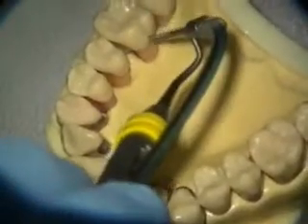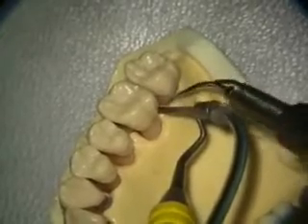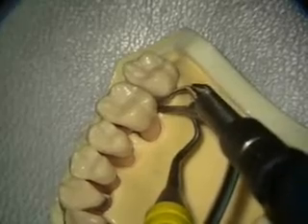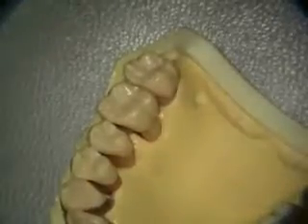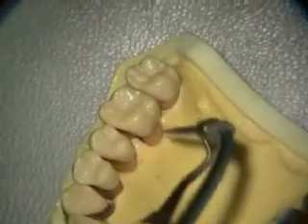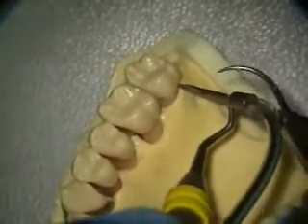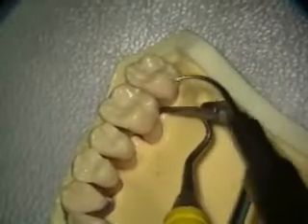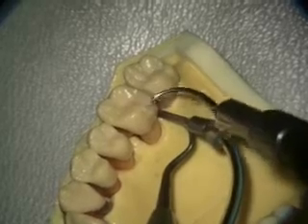Now, sometimes at the very distal aspects of these furcations, the angle that we have on the ultrasonic isn't angled back enough. So in the case of not being able to reach a certain area with the straight one because it doesn't angle back enough, I will use the curved ultrasonic.